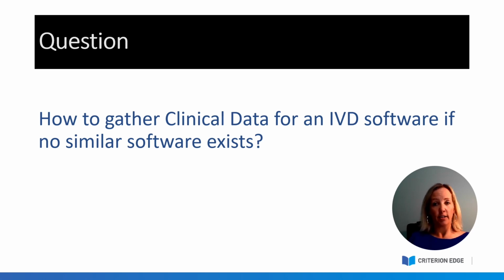And don't be afraid to look for medical device software, not IVD software, but medical device software that has similar functionality, similar algorithms, and is trying to treat or diagnose the same clinical condition, same intended purpose. You might use a combination of devices. Maybe there is an IVD software that has some of the functionality that your software has. You can use that as a comparator. And then maybe there's medical device software that has the other functions that your software has. Don't be afraid to mix and match at this point because we have limited information for IVDs, limited data.